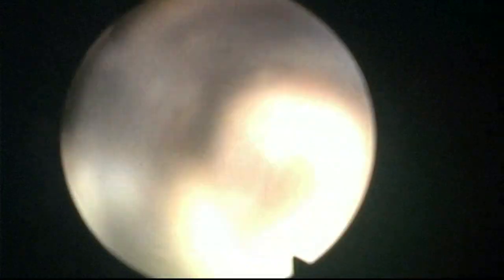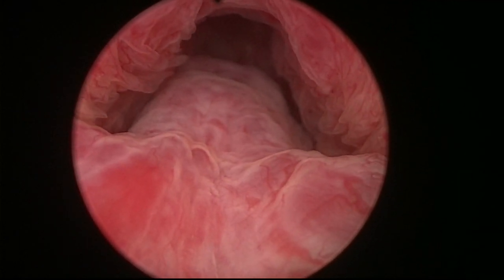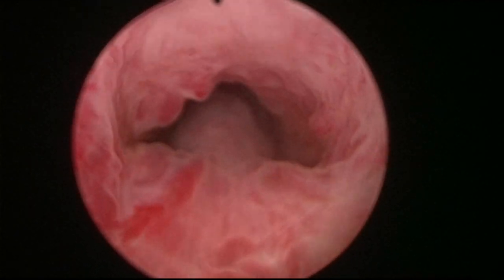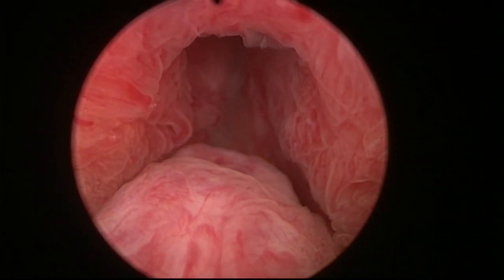We are going to change to the endoscopic image. If the quality is not good enough, tell me — sometimes we can focus a little bit better. Watching here, we are approaching the sphincter area, and it is very important to protect this sphincter area.